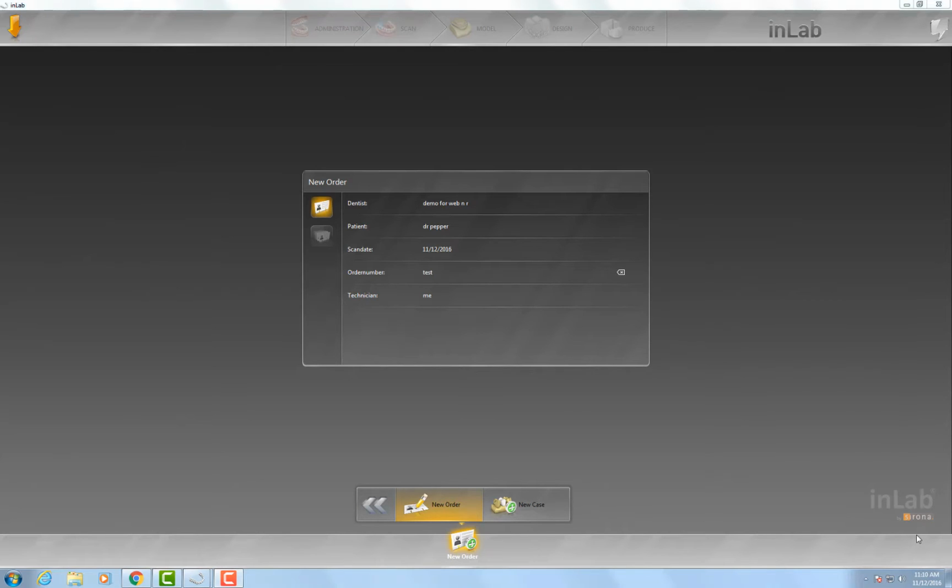And so what I was going to show you today are a few tips and tricks on how to start utilizing the IPF software in your lab, whether you are a 60-partial-a-day lab, a 1-partial-a-day lab, or a 1-partial-a-month lab.